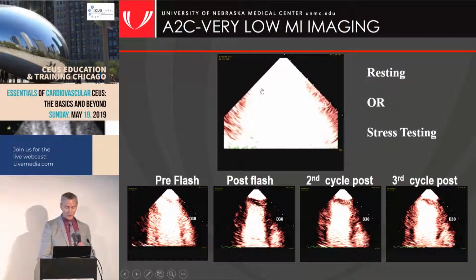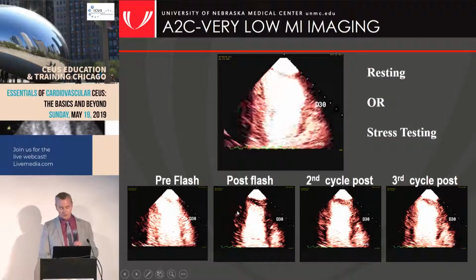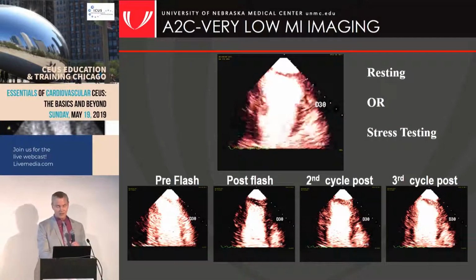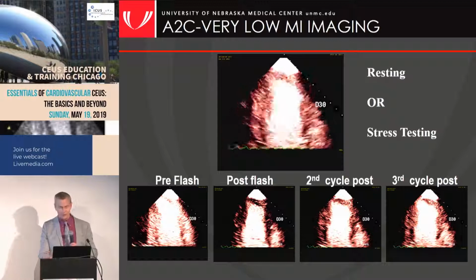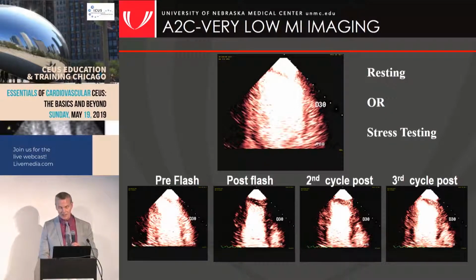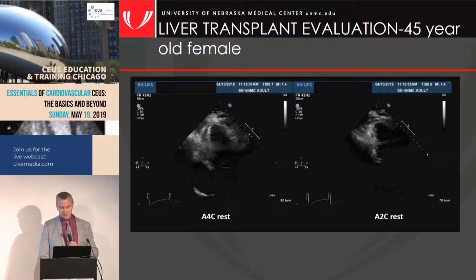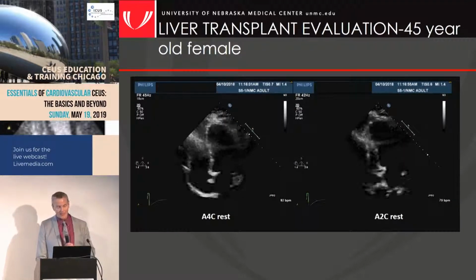If we have a question, we go back and do what we see on the bottom screen here. We roll back on the screen and look at these end-systolic images in the first 3 seconds or so after the high MI impulse, and that helps us a lot in an area where we're questioning where wall thickening is abnormal. Perfusion will clearly be the first abnormality you see before wall thickening. So if perfusion is normal, wall thickening will be normal. So that's why we use this technique day in and day out as an add-on to our wall thickening assessment. So I'll show you just a few examples of that.